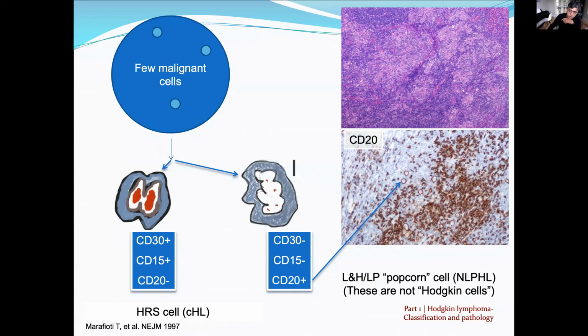This morphology that I'm showing is important because there's a progressed version of this lymphoma that I'm going to show you later called T-cell rich large B-cell lymphoma. So when nodular LP goes bad, it goes into that lymphoma called T-cell rich large B-cell. There's a continuum right there. Despite all these differences, both these lymphomas actually arise from B cells. It's actually a germinal center B cell, and it's a highly mutated germinal center B cell. And some of that work was elegantly proven by Teresa Marafioti's group.